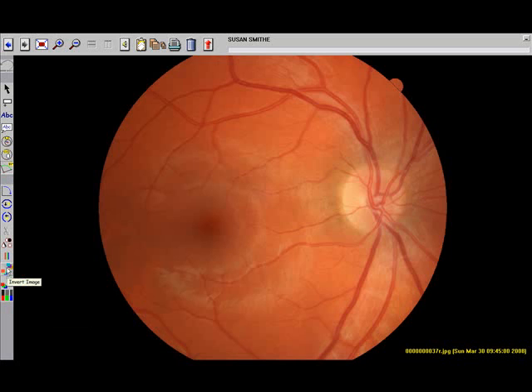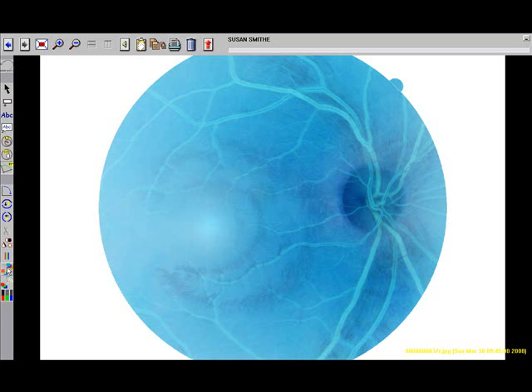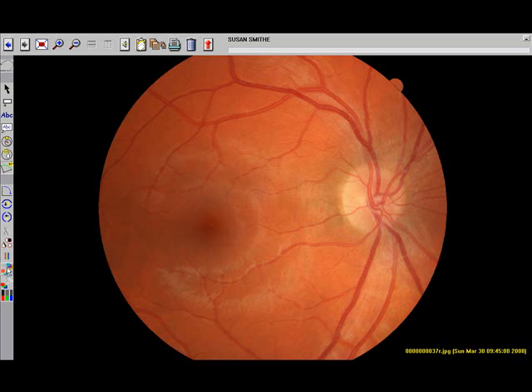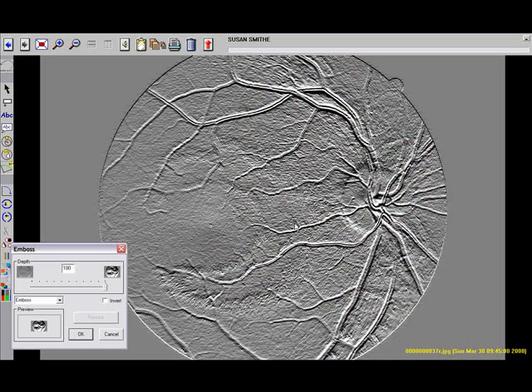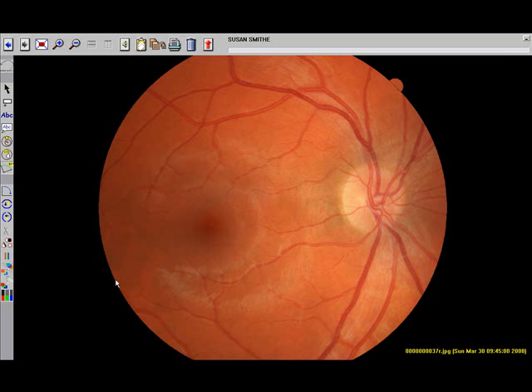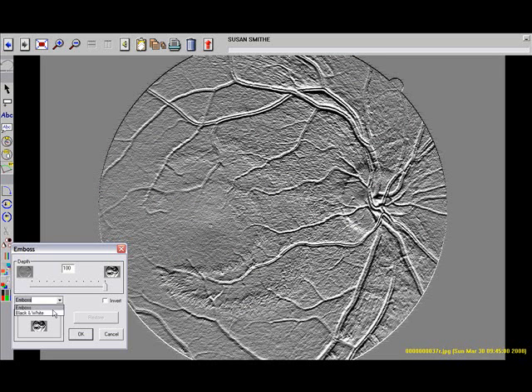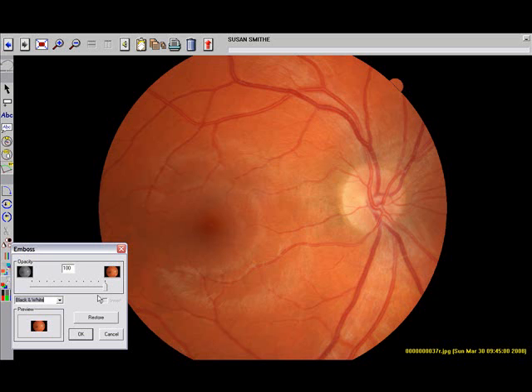If you wish to see a negative image, press the Invert tool, and then press it again to return to a regular picture. The Emboss tool is used to make one picture into a 3D image; this is very useful in patient education. If you wish to make a black-and-white image, press the Emboss tool, use the pull-down window to go to black and white, and slide the color out of the image.